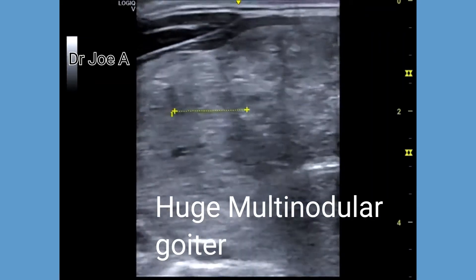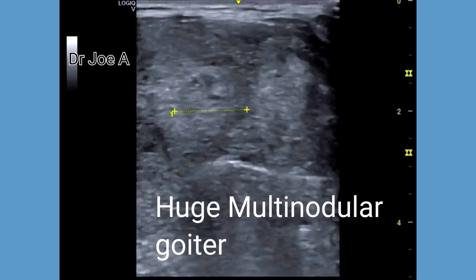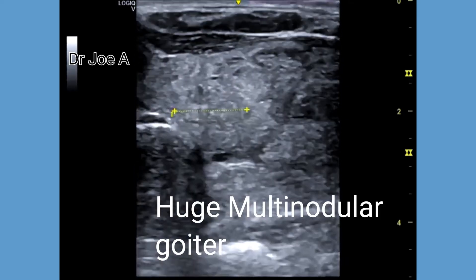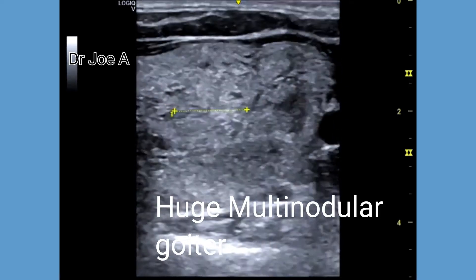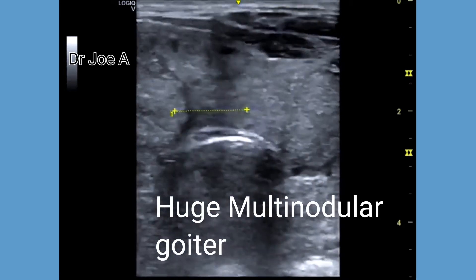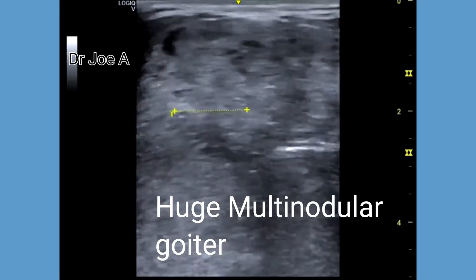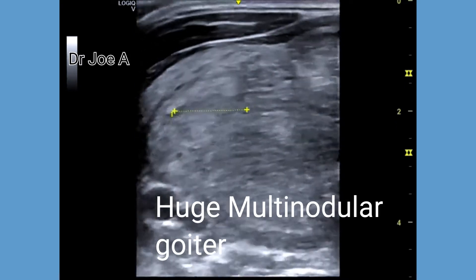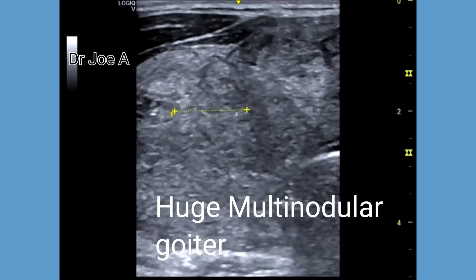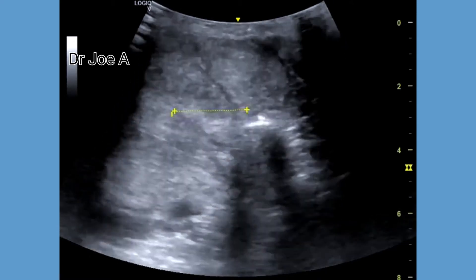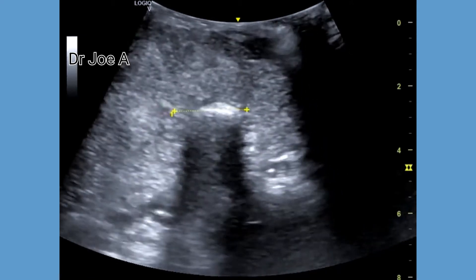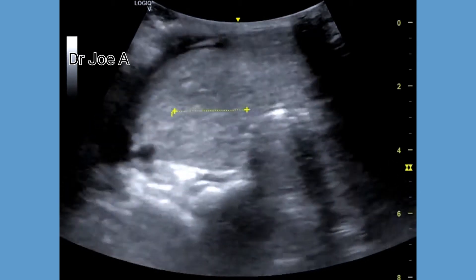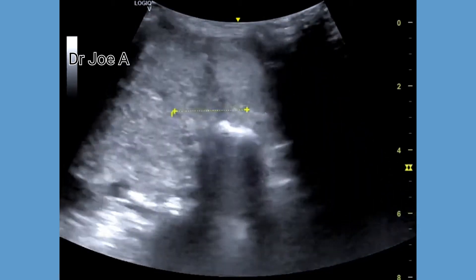This patient has a diffuse enlargement of the thyroid. Multiple solid nodules are present throughout the thyroid gland, and the isthmus of the thyroid gland also measures a width of 2.5 centimeters, which is very high. There is also evidence of retrosternal extension of the thyroid into the upper part of the mediastinum.